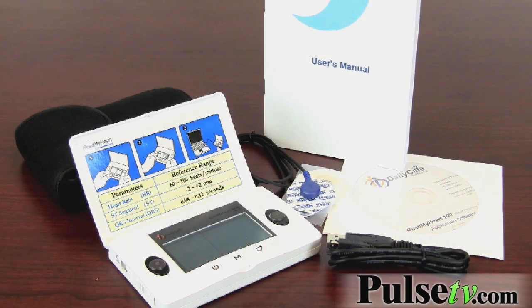In all seriousness, it's actually a very valuable health monitoring device. As everybody knows — or maybe you don't — ECG stands for electrocardiogram.